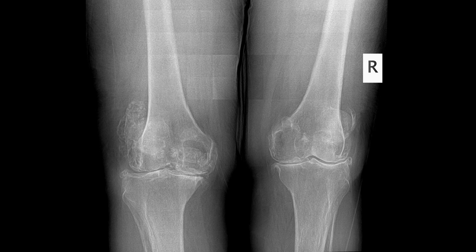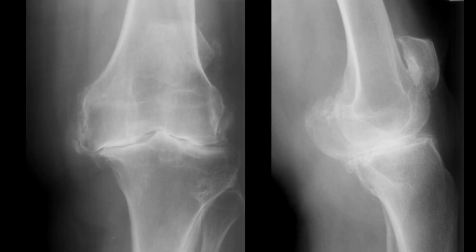This individual has moderate to severe loss of the joint spaces bilaterally, as well as significant osteophyte formation, alteration to the joints, intra-articular loose body formation, and patellofemoral osteophyte formation. This patient has tricompartmental degenerative joint disease, meaning it's within the femoral tibial joint spaces as well as the patellofemoral joint spaces.